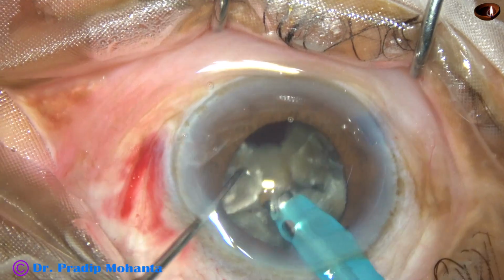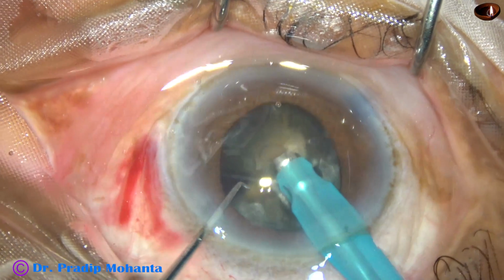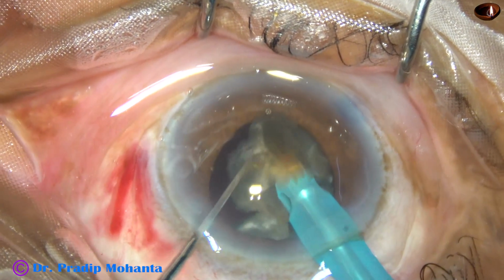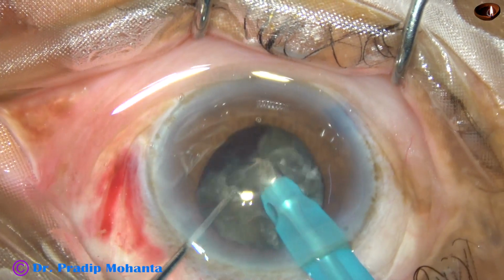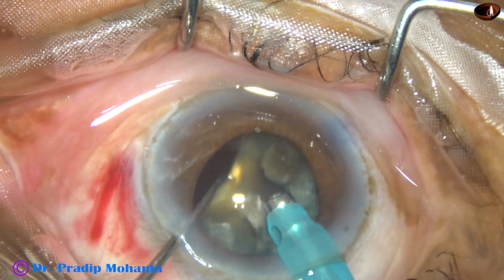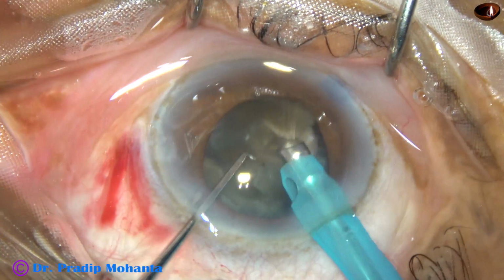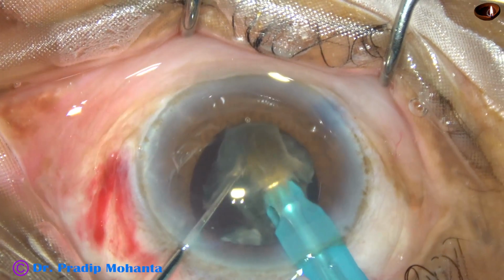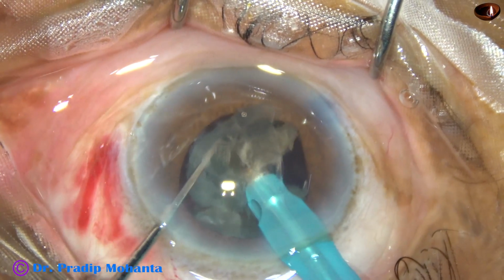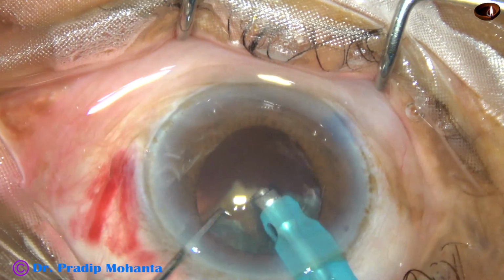So this is a very efficient technique of nucleus management in hard cataracts. Yes, I respect all surgeons. Every surgeon has his or her own techniques. As long as you get good results, if you get clear cornea, quiet anterior chamber, a happy patient next day, your technique is good. So don't say my technique is bad and your technique is good, or my technique is good or your technique is bad. As long as your technique gives good results, it is good.